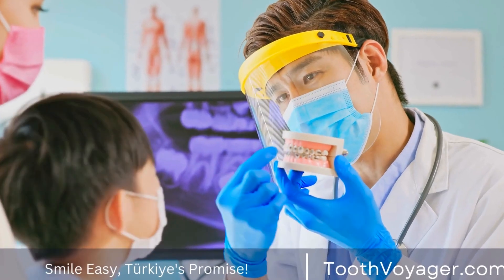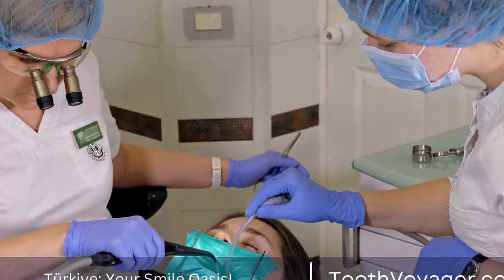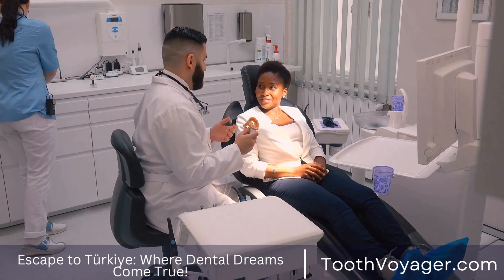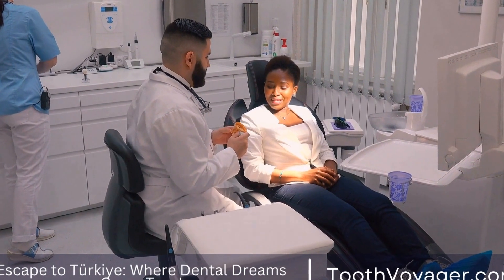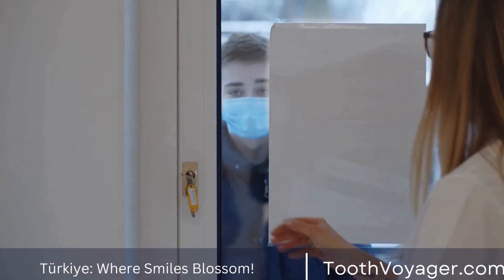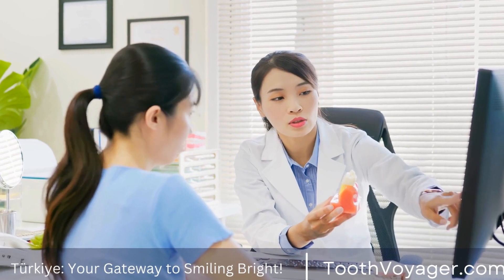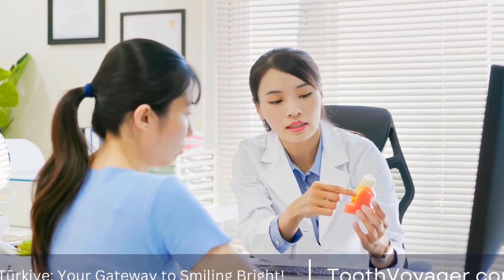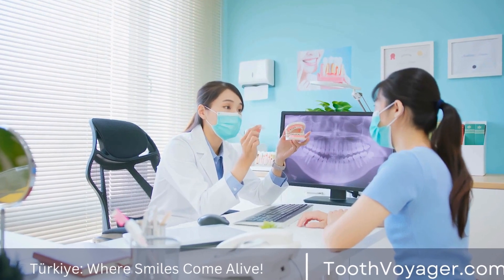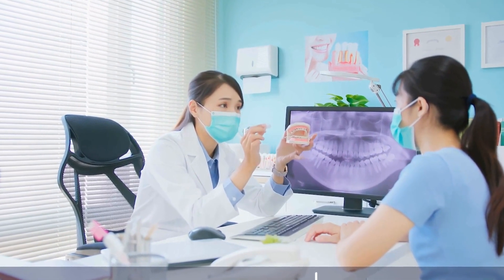Preparation of the teeth. After you've decided to use a dental bridge, the next step is to prepare the teeth that will hold the bridge. This typically involves removing the enamel from the natural teeth on each side of the gap, allowing enough space for the crowns that will keep the bridge in place. A second set of impressions is then taken and sent to a dental laboratory where the bridge is custom fitted to match the appearance and color of your natural teeth.